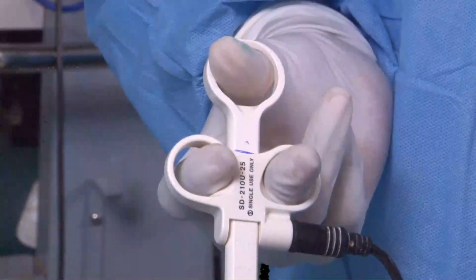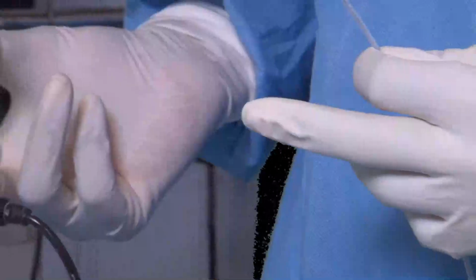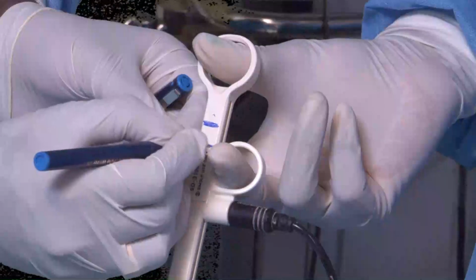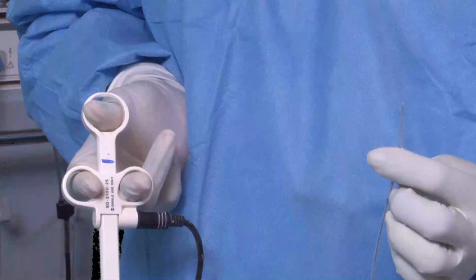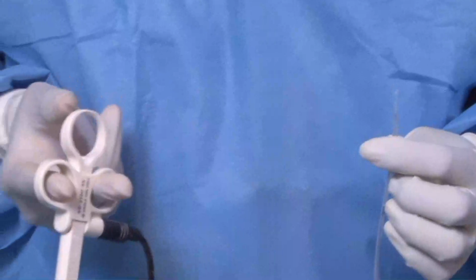So I have to ask her to stop somewhere beyond, before this. Actually, somewhere here itself. Another point. See, that's the point. See, this is the point. As you can see, the wire is hiding inside. I can go further, and this is very tight. This is completely closed. So this is a very, very important thing for a beginner.